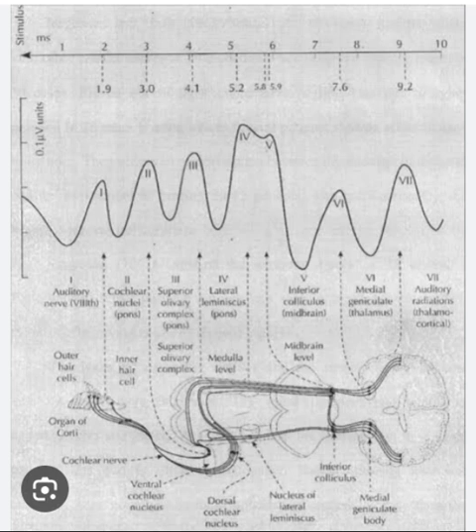Normative data. Normative data provides reference values for BERA waveform characteristics in the general population. It serves as a basis for comparison when interpreting individual test results. Normative data can vary depending on factors such as age, gender, and stimulation parameters. It is crucial to consider the appropriate normative data for the specific population being assessed.